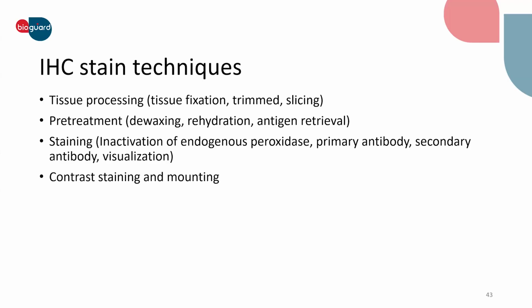The second step is pretreatment. Next, the slides are deparaffinized and rehydrated. Then we perform antigen retrieval, usually with heat or enzymes, to unmask the antigens that might be hidden due to fixation. This step helps the antibody bind more effectively.